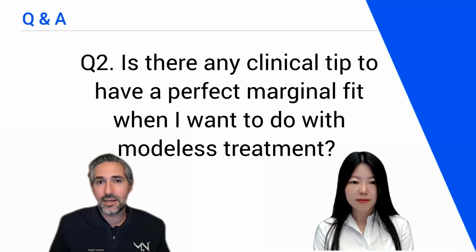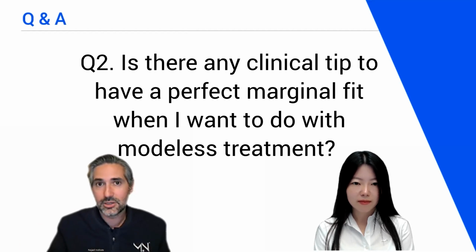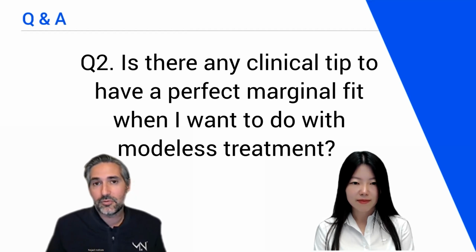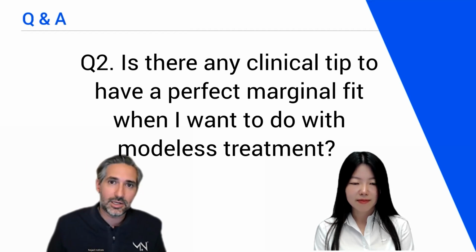So I guess what I would say is getting calibrated, and it's the same for everything, even if it's veneers for the anterior: getting calibrated with your impression technique or your scan technique, the material and the technician or the technology. When you're doing this stuff, you might be the technician and the technology and you're in charge of it. So you just have to get calibrated. What we normally do is write down if we notice that the occlusion was high or the contacts had a lot of adjustment, and I check it and start fine tuning. So it's all based on the material and what you're going to do.